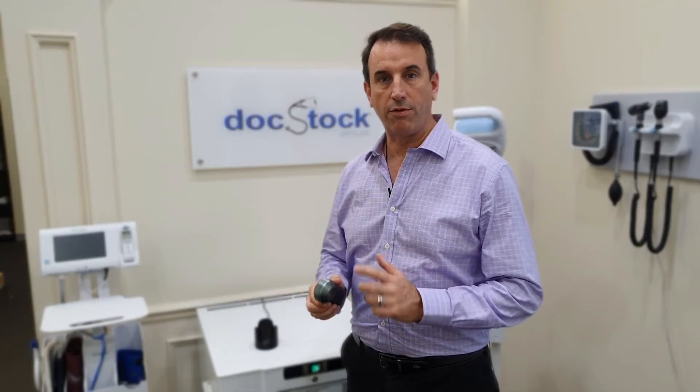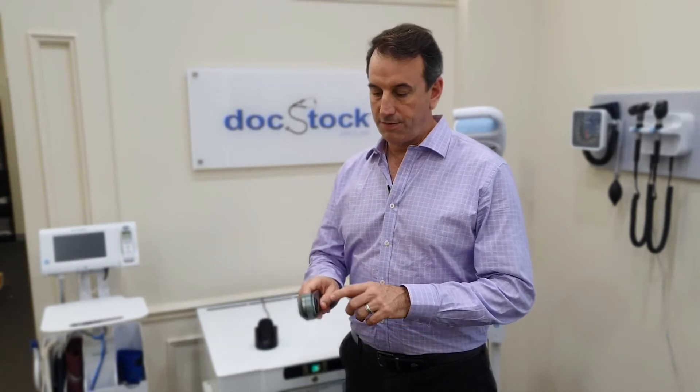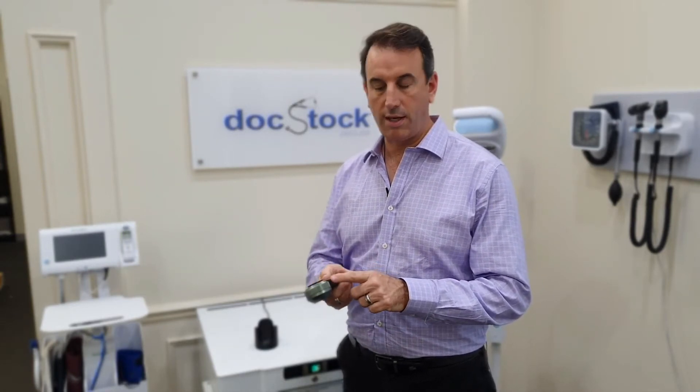Hi there. I just wanted to quickly run through the basics of using the Dermalight DL3 Dermatoscope. This device has got a power button and polarisation change button on one side, and a pigment boost button on the other side. That's when it's been looked at from the practitioner side — this is the contact plate for the patient.